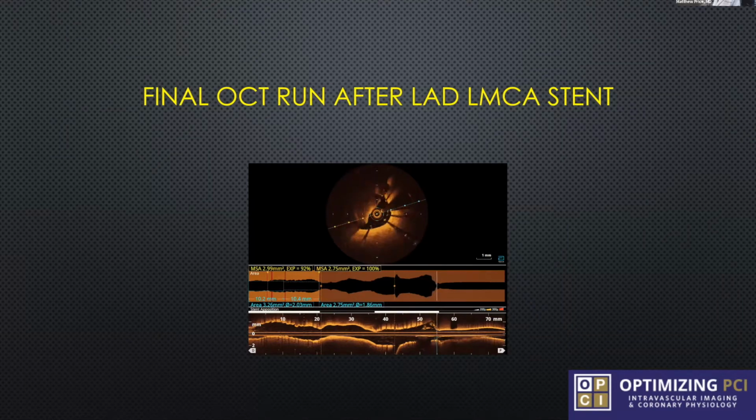there. Right there. And what happens is it gets hidden in the blood swirl, right? Exactly. So I missed it. It came through in the blood swirl. I looked at the whole thing. It was looking fine, and I blew it.